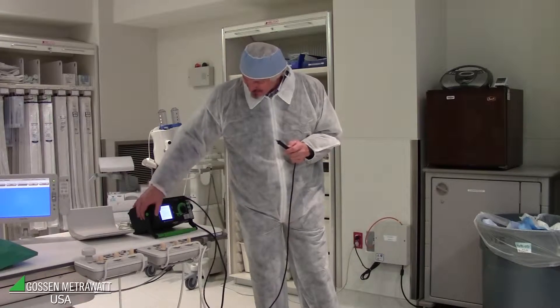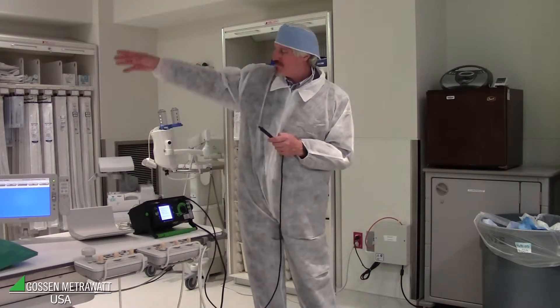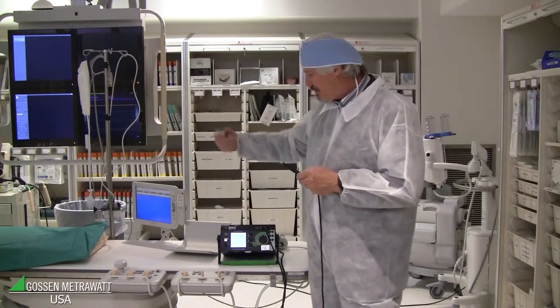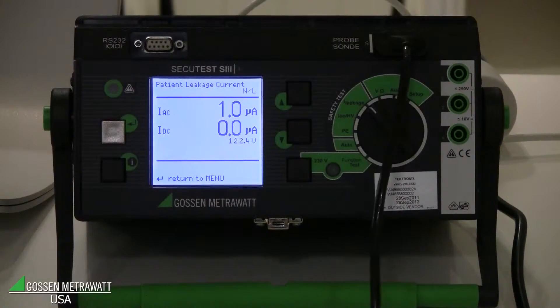We connect the power supply and the probe, then start the touch current measurement. The device is fixed and installed, mains is already switched on, and the device has already booted, so we can start. We can see the touch current is zero or near zero because the probe is not yet connected.